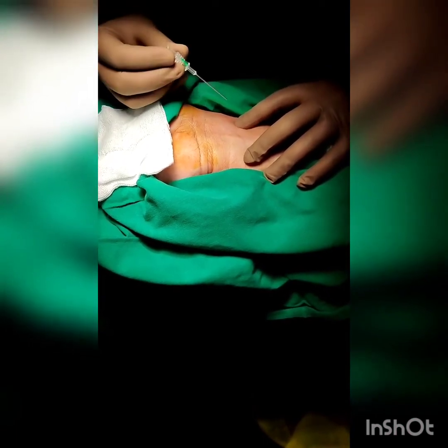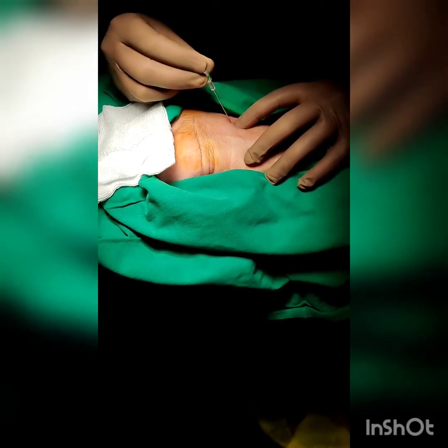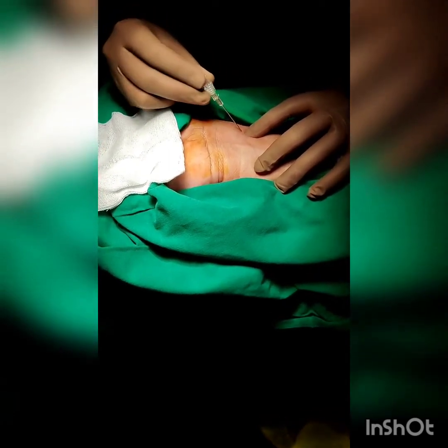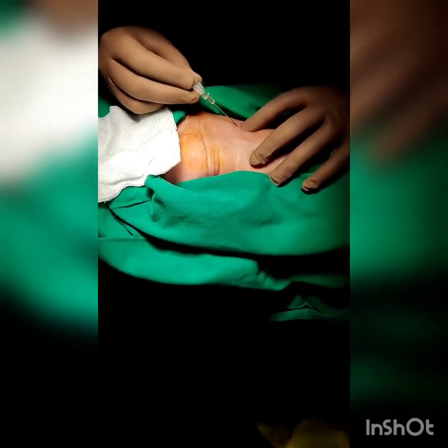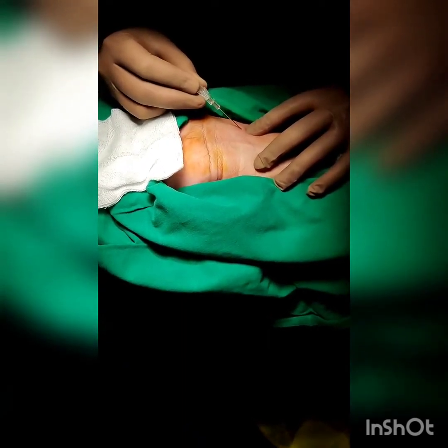Palpate the pulse with a non-dominant hand while holding the introducer needle in the dominant hand like a pencil. Puncture the skin with the introducer needle at about 45 to 60 degrees. Once the skin is punctured, tilt the introducer needle to around 30 degrees for further advancement.